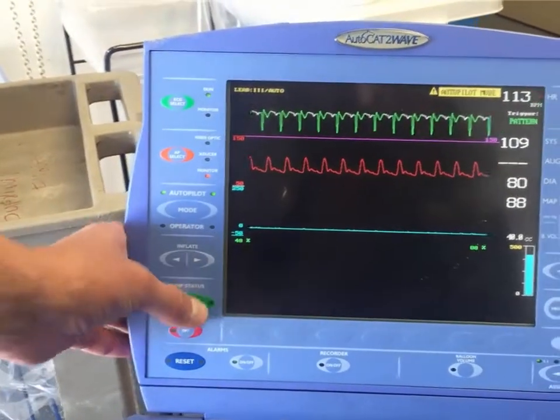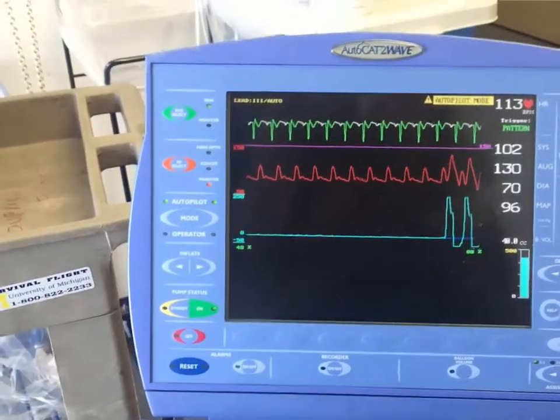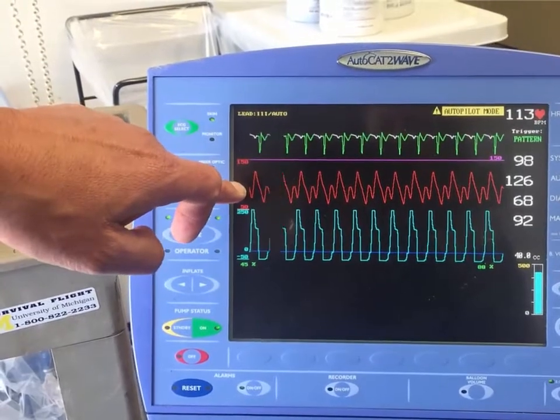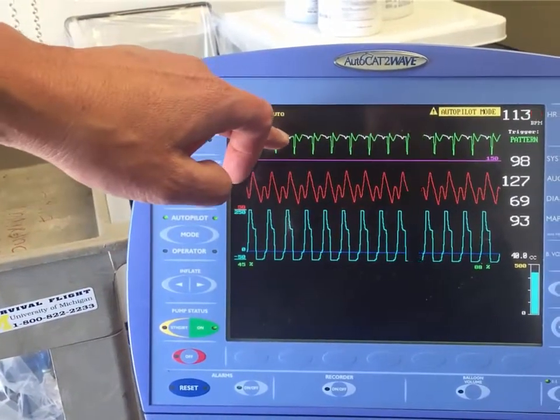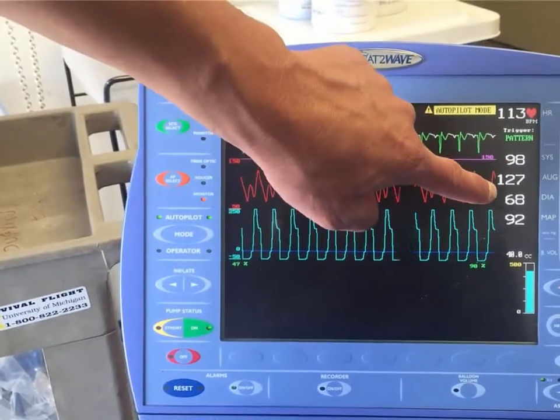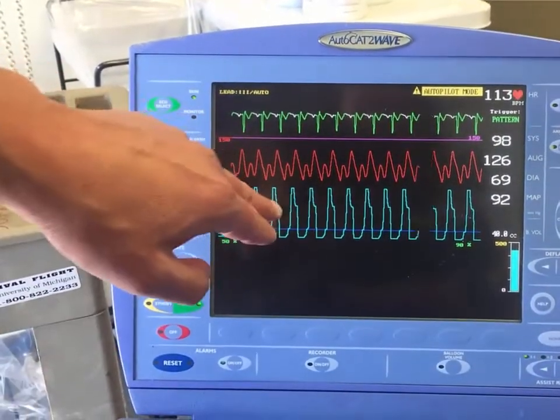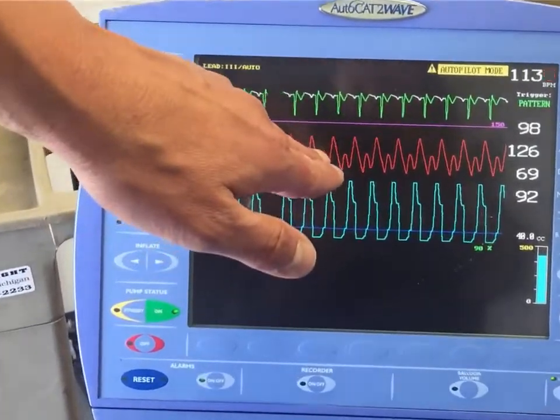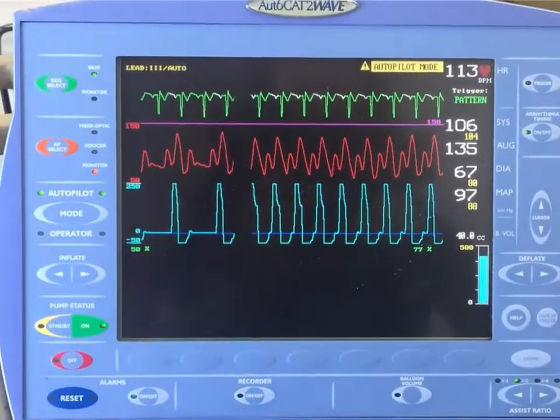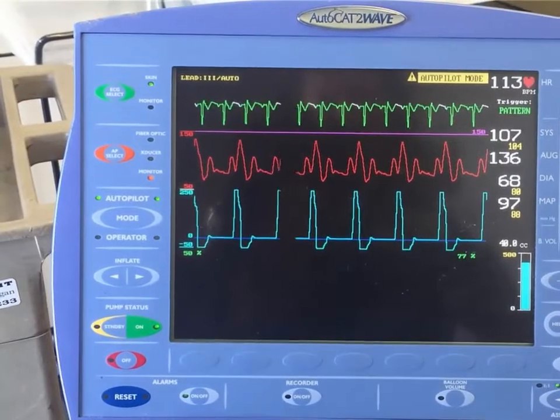In autopilot mode, we are ready to initiate counterpulsation. Hit on, and you will see the balloon inflation waveform along with the arterial pressure waveform with augmented arterial pressure timed off the R wave or ECG lead. We have a systolic pressure of 98, diastolic of 68, with an augmented pressure of 127 — working well. We are in a 1-to-1 timing assist ratio. We can change it to a 1-to-2 to establish whether or not we need to adjust our timing at all.